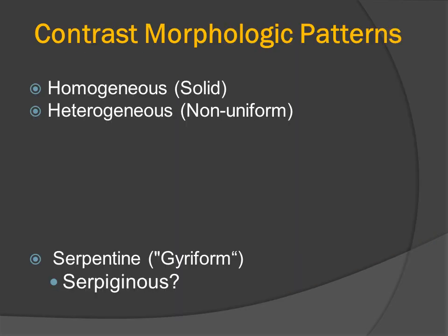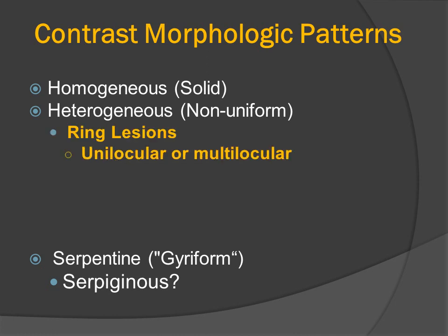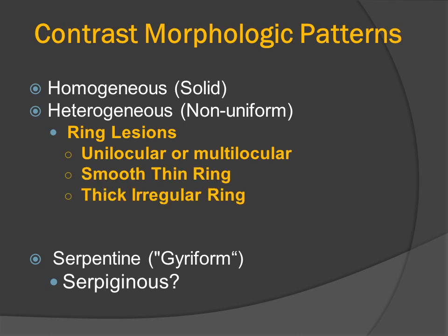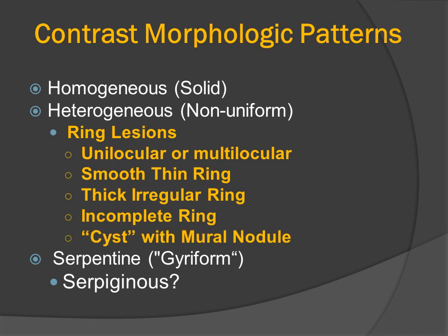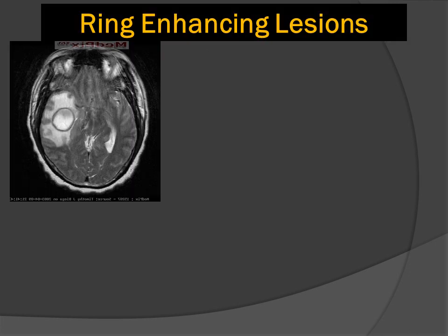There are many different patterns of contrast morphology. We can have homogeneous enhancement, heterogeneous enhancement, and superficial or serpentine enhancement. We can also have ring lesions. They may be unilocular or multilocular. They can be smooth and thin, thick and irregular. There can be an incomplete ring or rim of enhancement, and we can also have a cyst with a mural nodule.